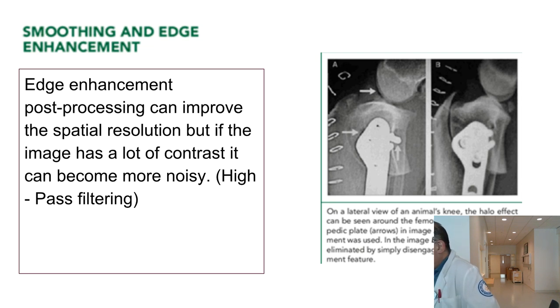The other thing to keep in mind, I make jokes about this, but the radiologist monitors are expensive and they have a lot of capabilities. You can see multiple windows. You can have the original image, a smoother image, and an edge enhanced image, all next to each other. It's not one or the other, and then you can never go back, right? You maybe can't go back to the raw data that I talked about, but you still have the image data that you can do a lot with.